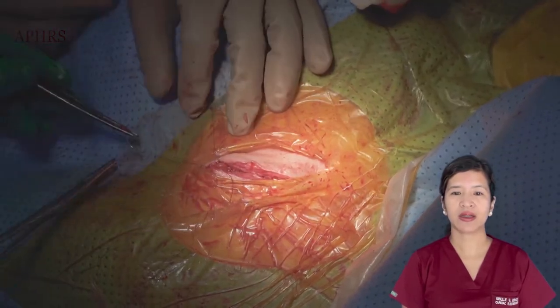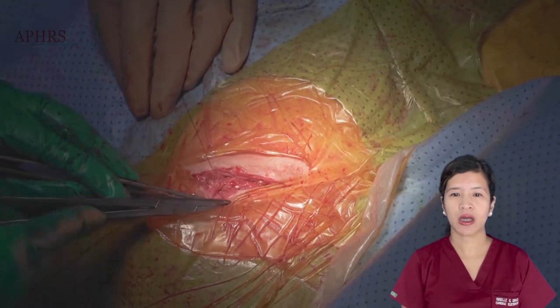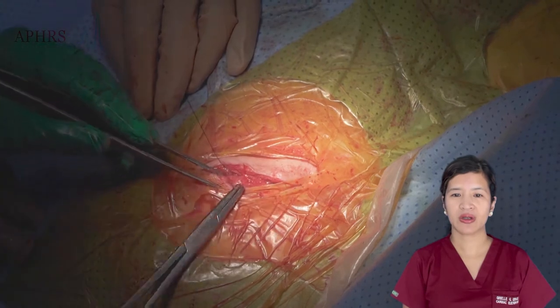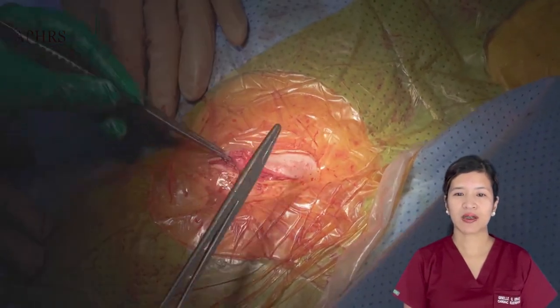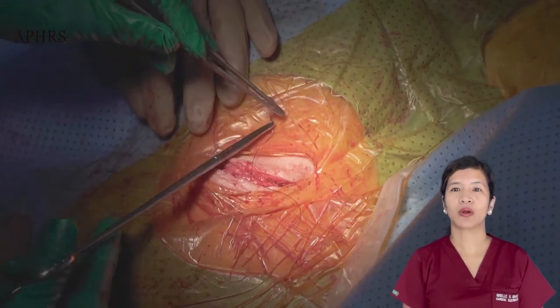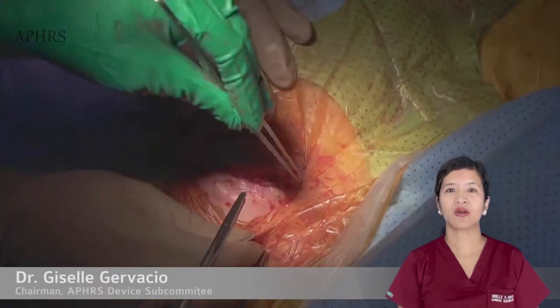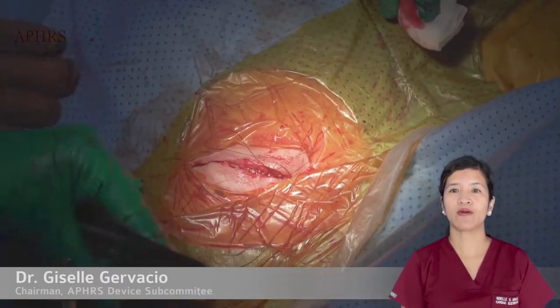At the end, we create a square knot and cut off the excess suture, then create the second layer by going backwards using the same vector vertical mattress. For the second layer, it is important to close out all potential spaces to avoid accumulation of fluid, which can be a nidus for generator infection in the future.